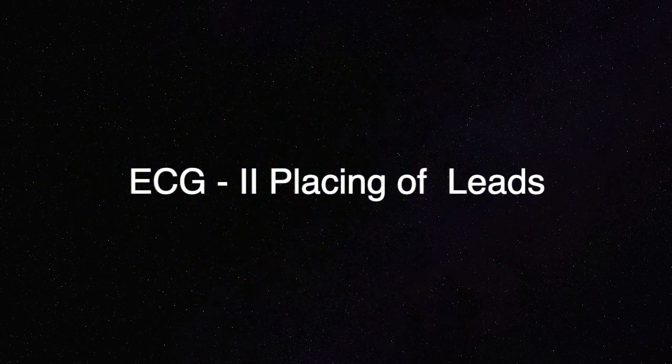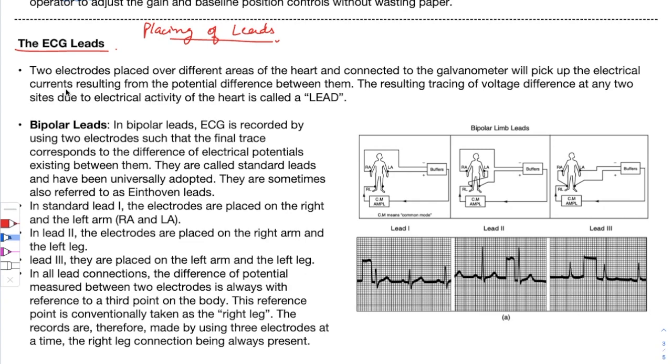Okay, so now we will understand about placing of leads. The two electrodes of ECG leads are placed over different areas of the heart, as we can see in our patients also. We place different electrodes on different parts of the body, connected to a galvanometer, which picks up the electrical currents resulting from the potential difference between them.